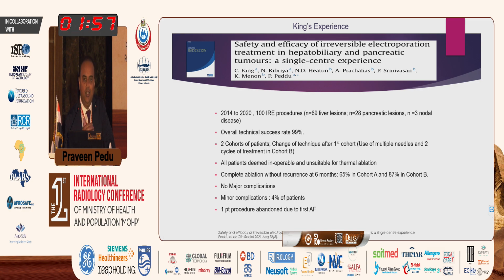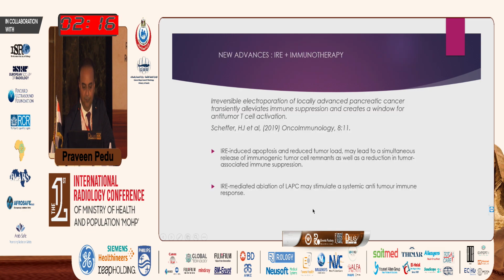So what I'm trying to give you is, this is not a simple technique, it's a complex technique, and the needle placement plays an important role in making sure you get the results you'd like. Okay. Complications, the majority of them are minor, and the only patient in whom we abandoned the procedure was the patient who developed fast atrial fibrillation.